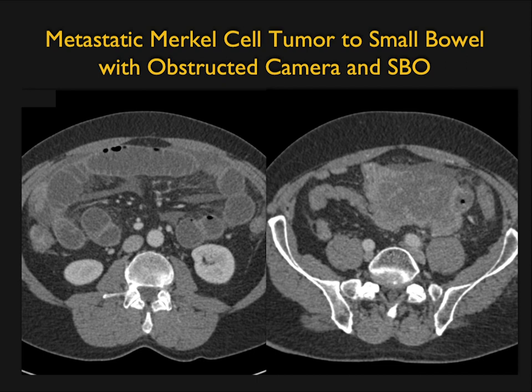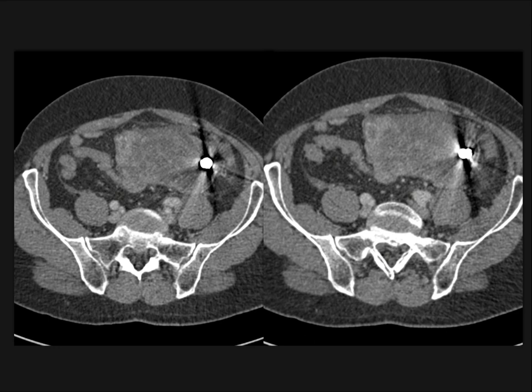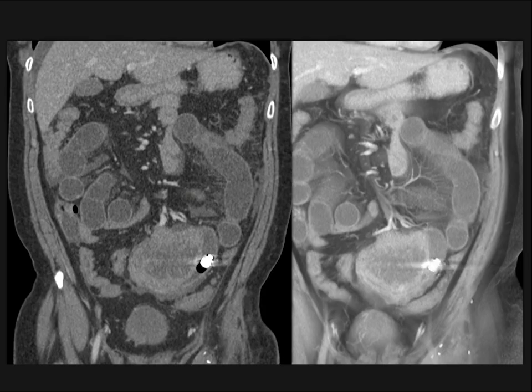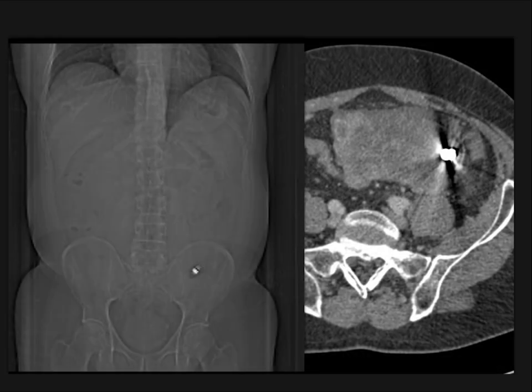Capsule endoscopy can miss bleeding due to poor prep, rapid transit times, or the presence of blood. If there's an obstructing lesion, the capsule can become obstructed and must be retrieved surgically. Here's a patient with a history of Merkel cell tumor and small bowel obstruction. There's a large mass, and the star-like bright structure is the patient's capsule — now obstructed near the bladder, visible on 3D and in the topogram, looking like a Sputnik in the left lower quadrant. You want to be very careful — don't do capsule endoscopy if patients have strictures, hernias, or other problems.